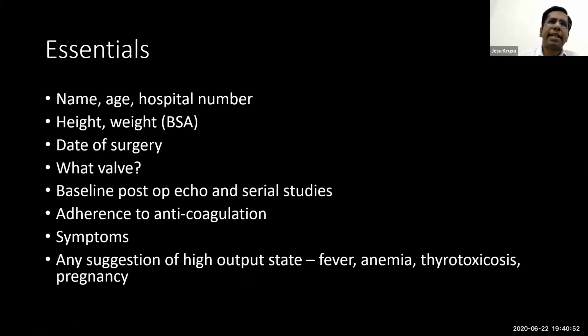Before we proceed with any study, this is something that we mentioned last time also. We should ensure that it is the right patient, the demographics, the hospital number, all those details are done properly. Height, weight, and body surface area is essential. Date of the surgery is extremely important, because from that we will know certain conditions which may occur closer to the surgical date.